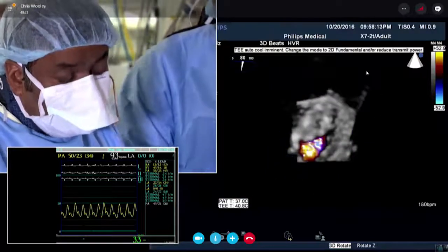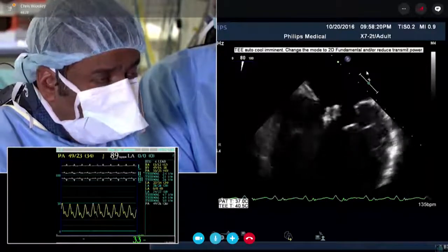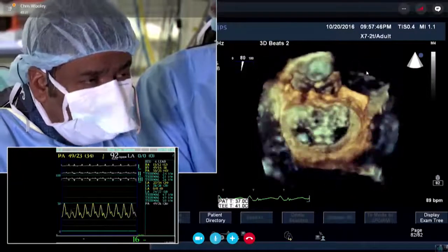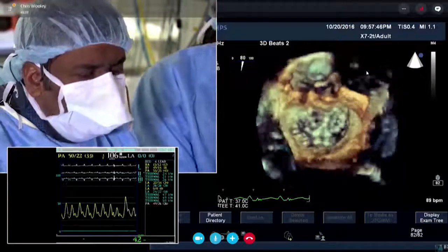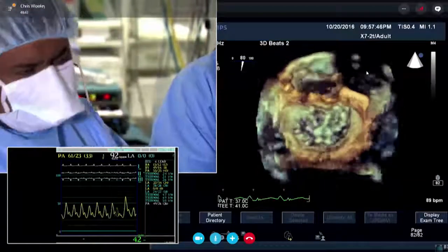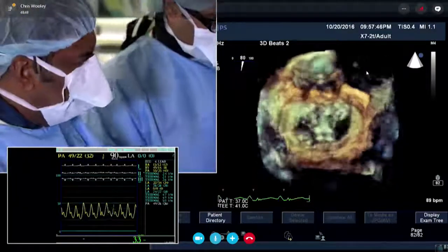Sometimes I just try a clip in the middle and see how it does. And if there's two tiny jets on either side, leave it alone. Or if there's one jet larger than the other, I just put another clip on the side. But you're right. If you get a big, broad jet, you should start slightly lateral or slightly medial of the middle. And it's preferable to start slightly medial. Thank you. Yeah, that's probably what we discuss at our workplace too.